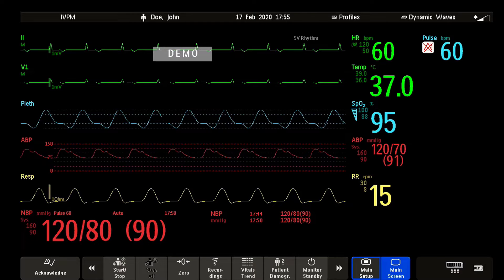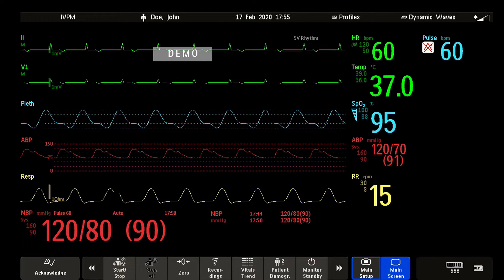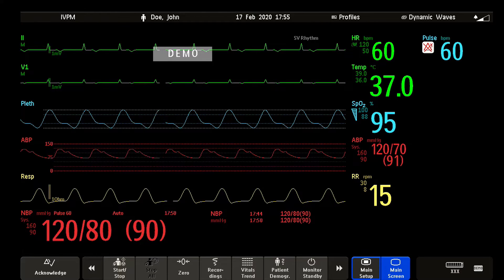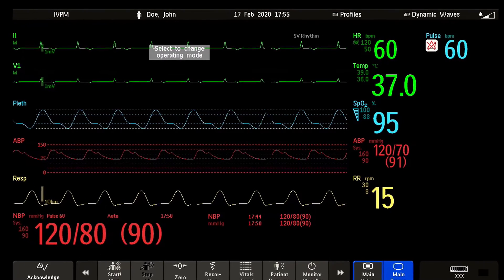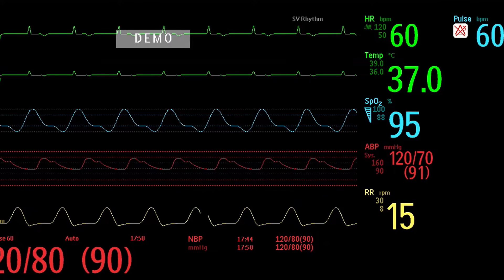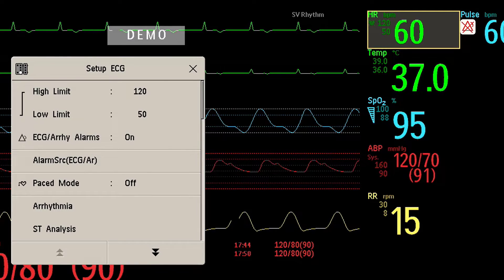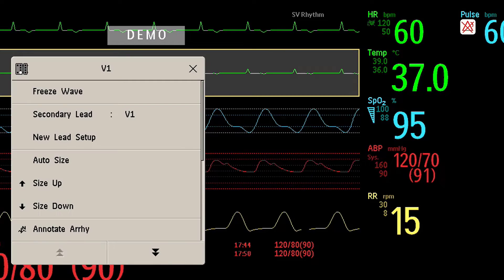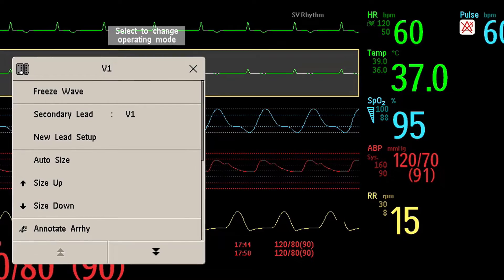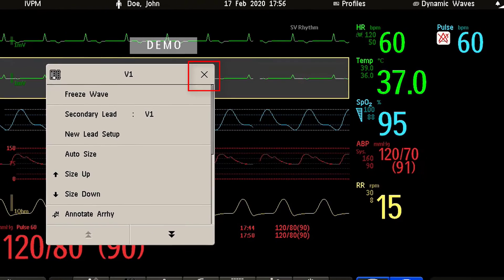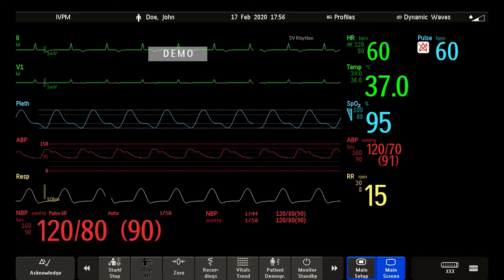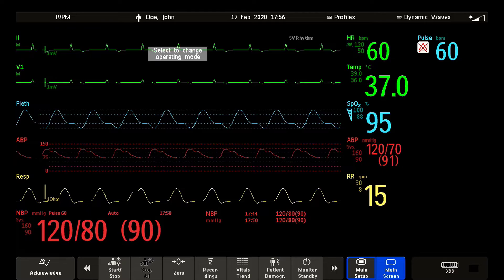Now that you know all the different screen areas, it is time to discover how you can operate on the screen. It's a touch screen — directly select the screen element you need. For example, select the heart rate numeric to call up the ECG setup menu, or select the ECG wave segment to call up the ECG lead menu. To close the menu, use either the X on the top right corner of the window or the main screen key below your screen. Note that you don't need to close a window before you can open another one — simply select another screen element.